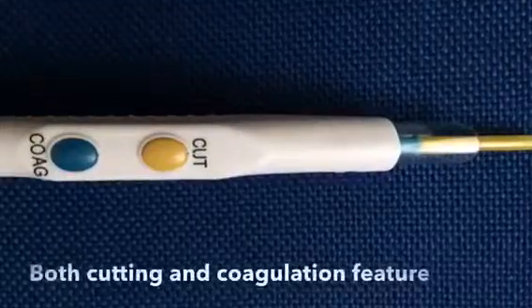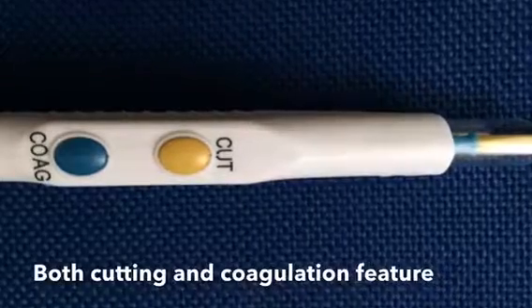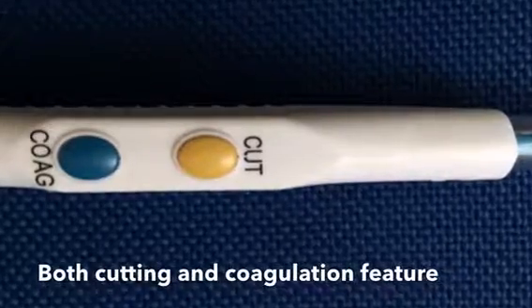The integrated smoke evacuation system allows to have, in a single device, cutting and coagulation with an effective removal of smoke produced during the electrosurgical procedure, while the hexagonal blocking system prevents the electrode from rotating during use.